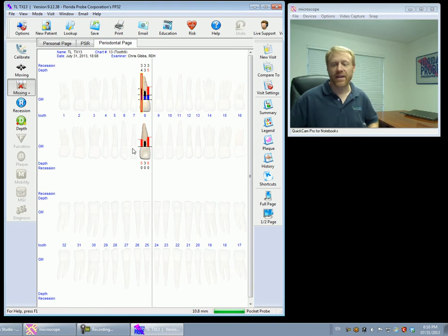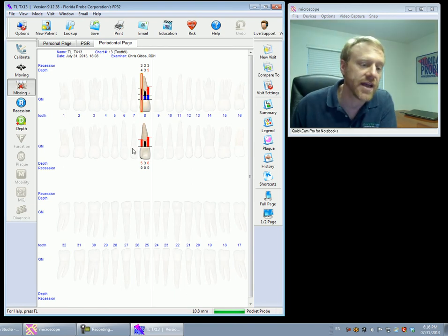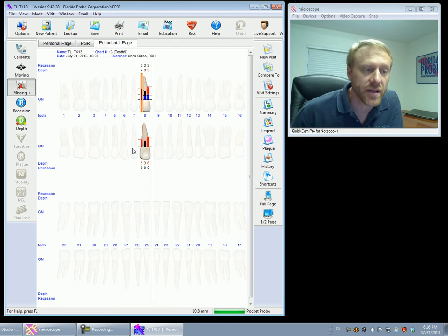Okay, that's our first training on how to set visit settings, and also how to probe using the handpiece. Thank you.